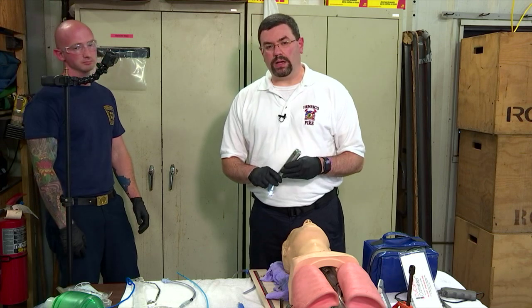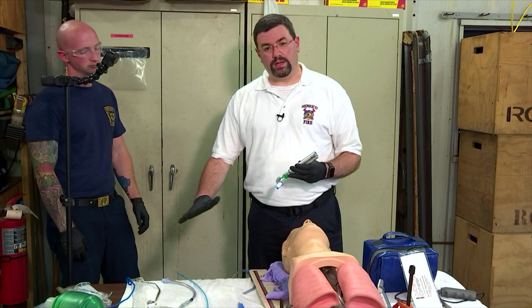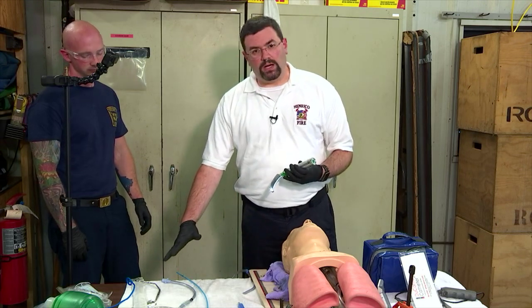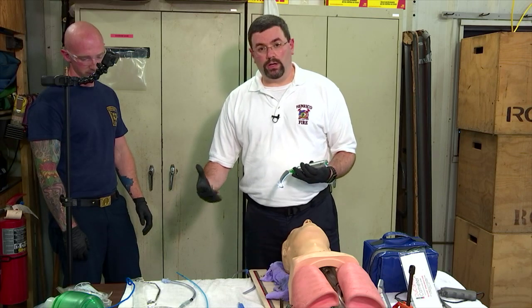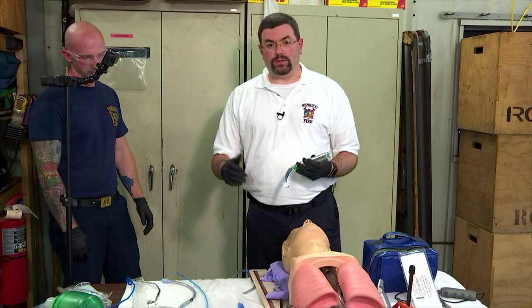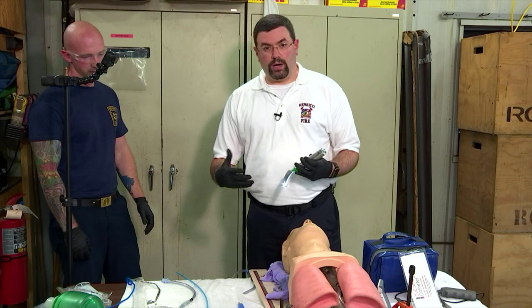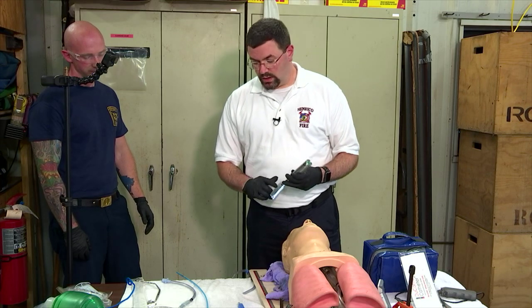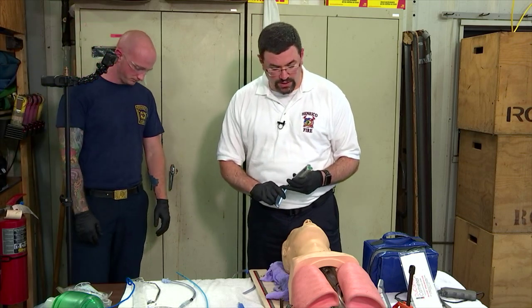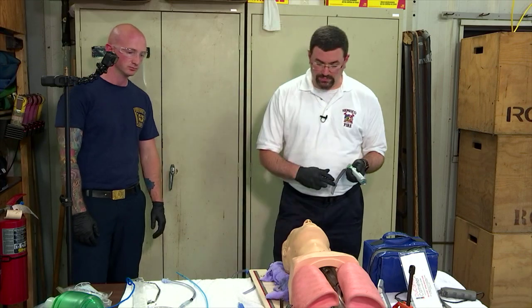You've heard me talk about our airway success rate, so I want to reinforce the idea of having everything laid out and ready to go. Make sure you have your suction, your bougie, your backup sizes and airways, everything you need to do the airway attempt without having to stop and bag and go back to your airway roll, your airway kit, in order to get more equipment. Hopefully I've got everything laid out that I need for this. I would have more equipment if this were a real airway attempt. Pardon the noise. Sean's going to get things started here and give me a little vomit.